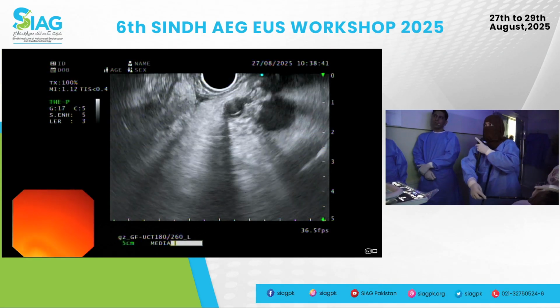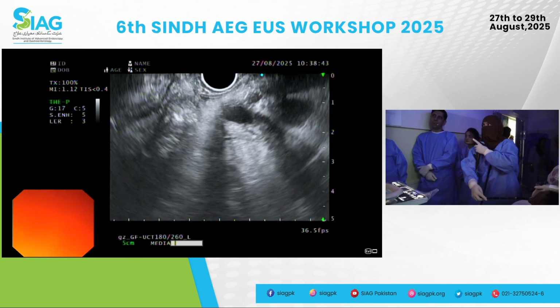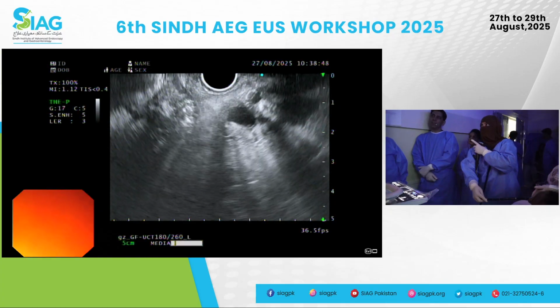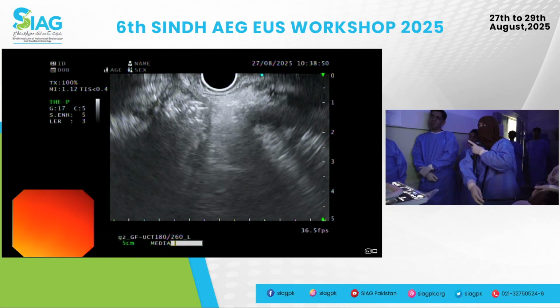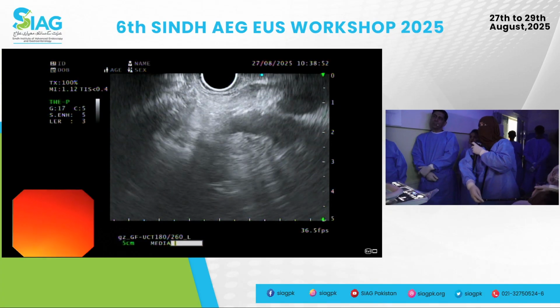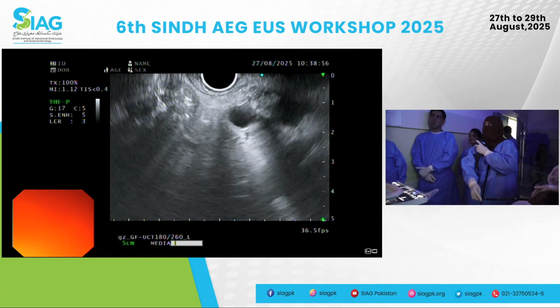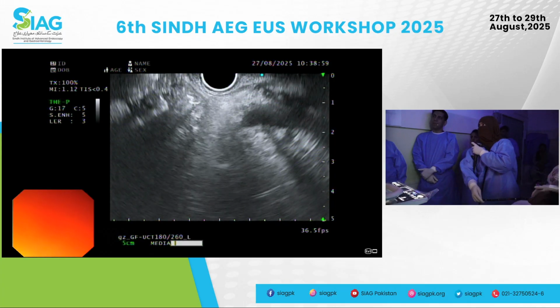Good, very good. Keep going. Very nice. Clockwise, keep going. Suction as well. You're losing it. Good. So if you lose the image, you undo it. You go back to where you were before. Good. That's enough. Okay. Keep going.